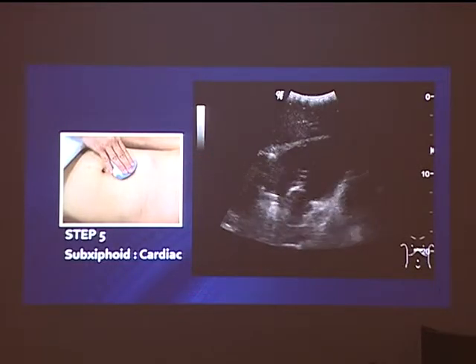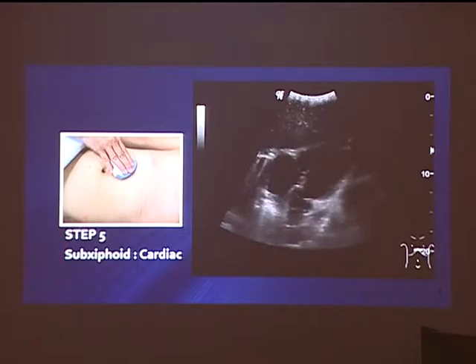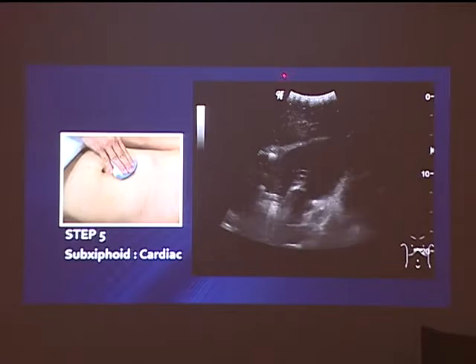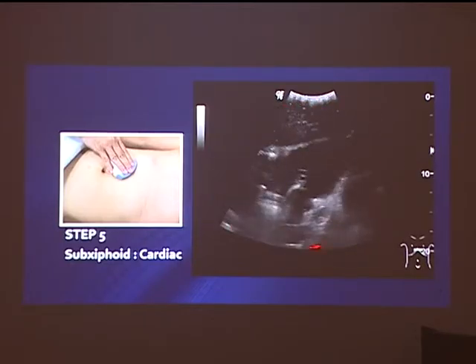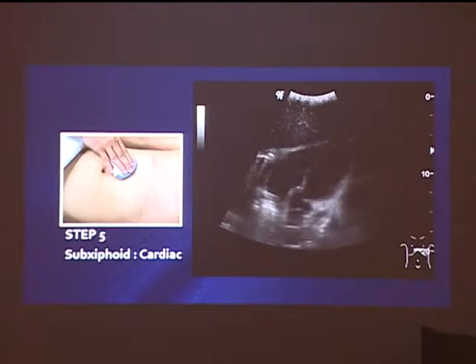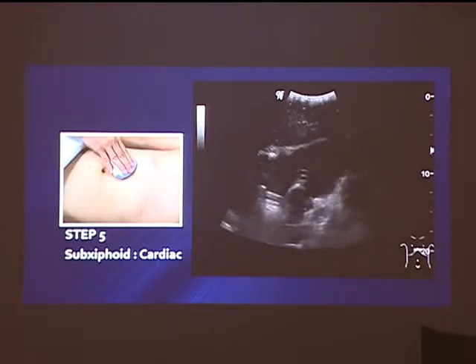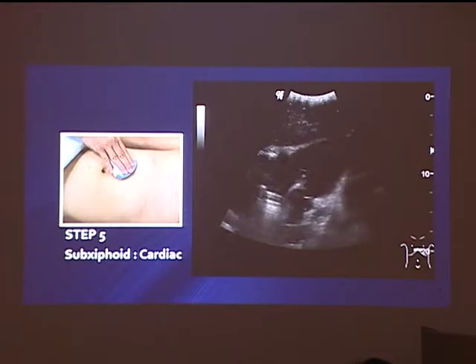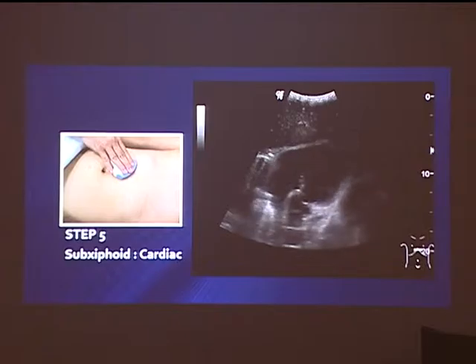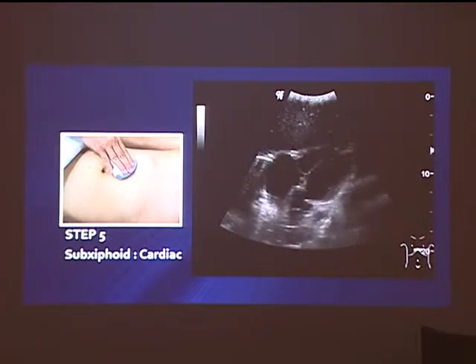Sub-xiphoid: the probe is placed flat onto the abdomen, scanning through the liver. The liver provides a good acoustic window to visualise the heart — right ventricle, right atrium, left ventricle, left atrium — to look for pericardial effusion, or hemopericardium in the context of trauma. Sometimes if the abdomen is very large and gassy, you have to shift the probe further to the patient's right to catch the liver window. In my practice I'll put the probe directly onto the chest itself, but that's not described in FAST — FAST describes the sub-xiphoid view.